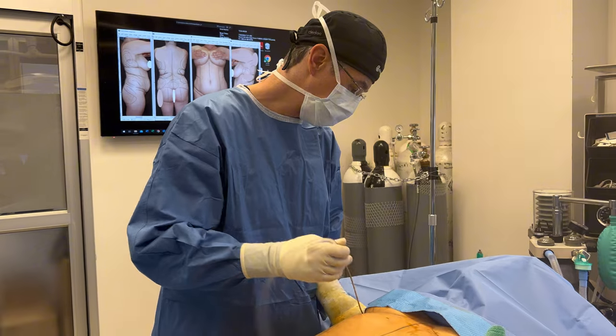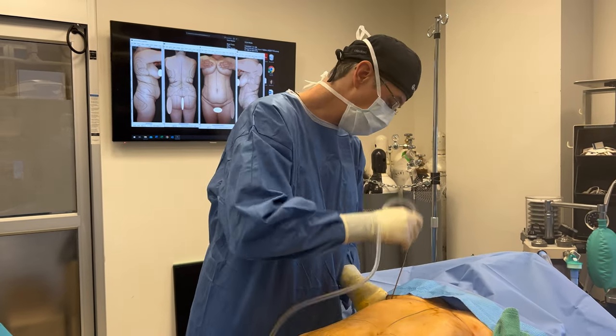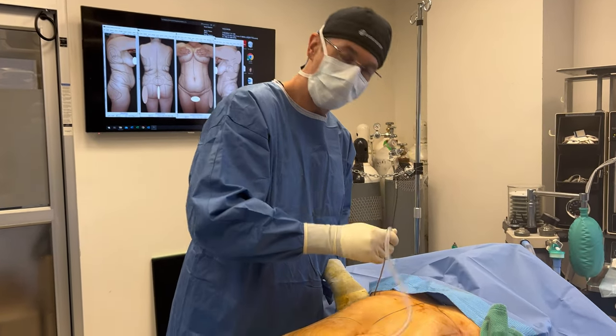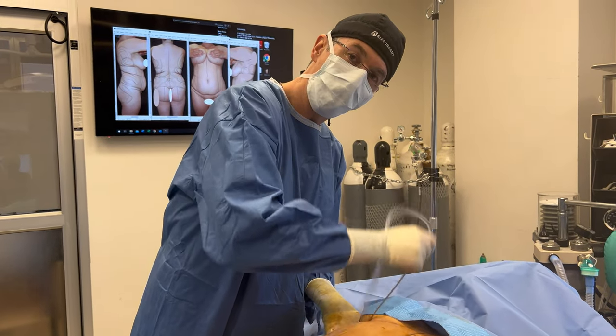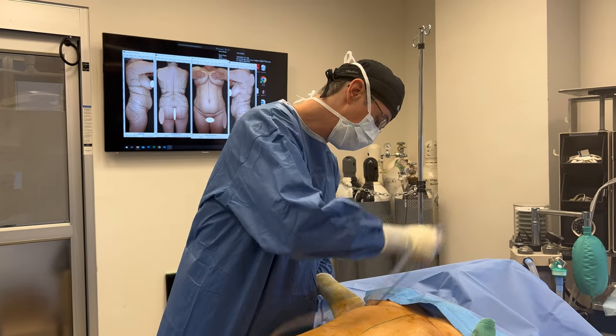So we're going to start by infusing tumescent solution, which contains saline and epinephrine for vasoconstriction. This is going to help soften the fat for separation and also minimize bleeding, because epinephrine is a vasoconstrictor — a medication that causes vessels to constrict so there's less bleeding during surgery.